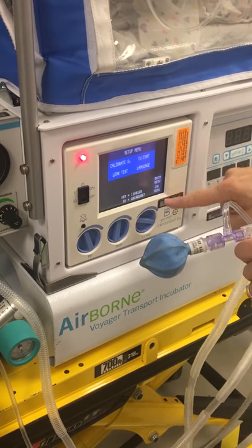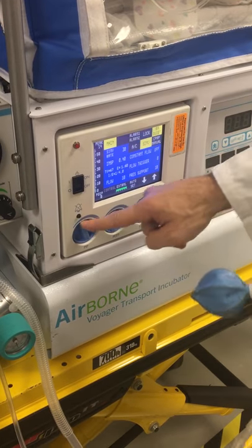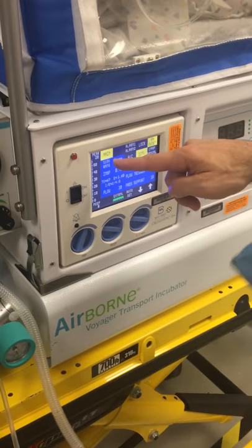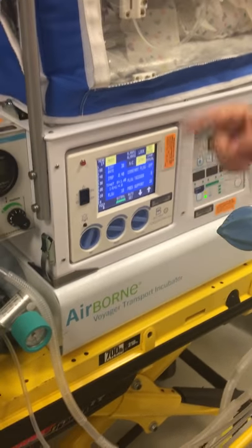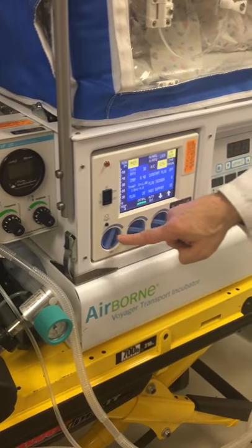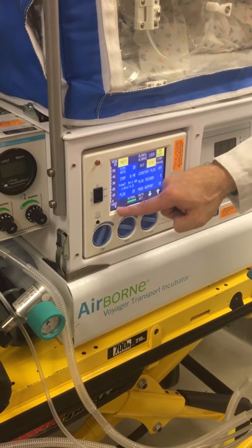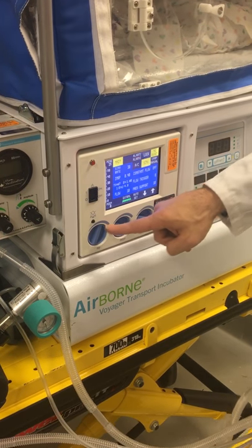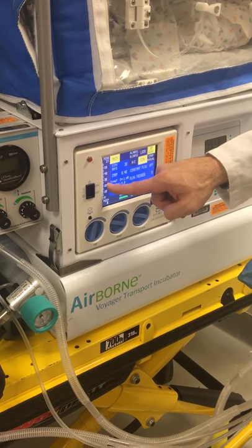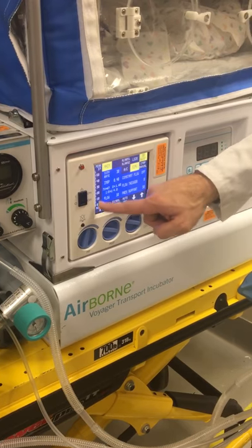Now we go to the set up menu, then main menu. When we're here, our pressure is all the way up. This is a pressure control ventilator, so if we want to set our peak pressure and our PEEP we use these knobs here. We can visualize the peak pressure and PEEP here. The peak pressure right now is 25 — if I want to do 20 I'll just knob this down a little bit. I can read 20 here and see 20 on the graph.